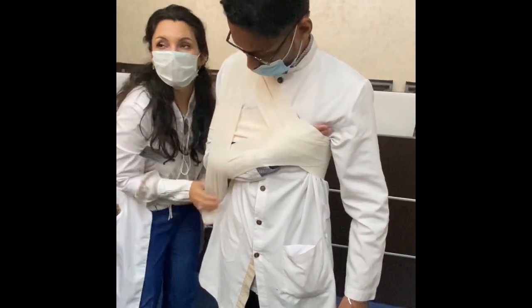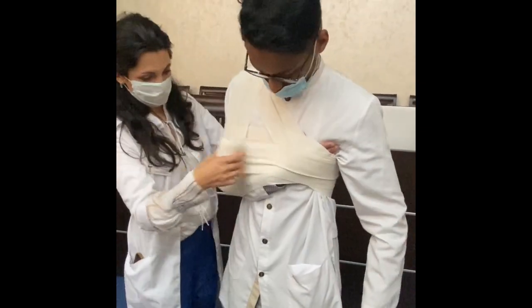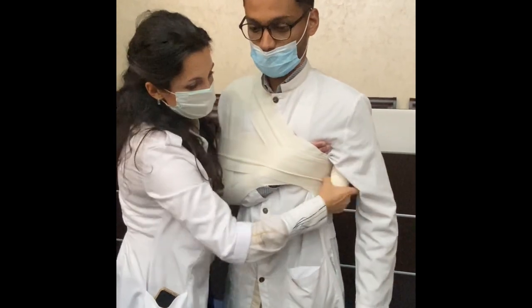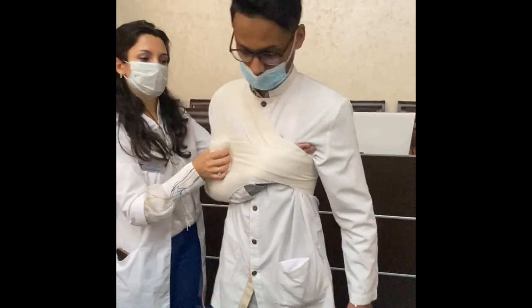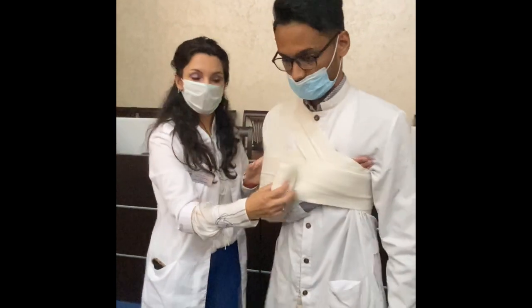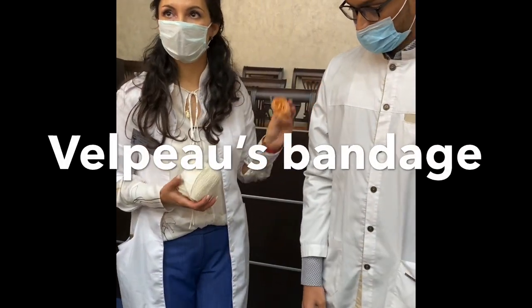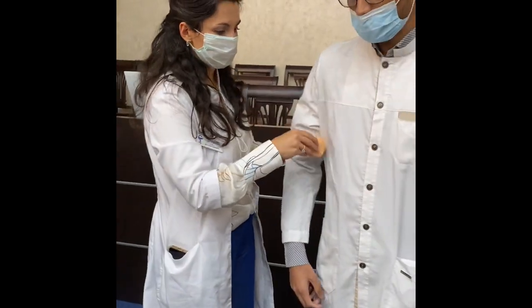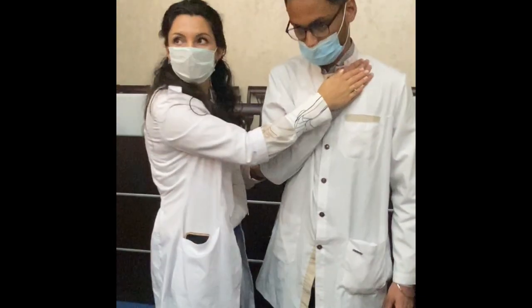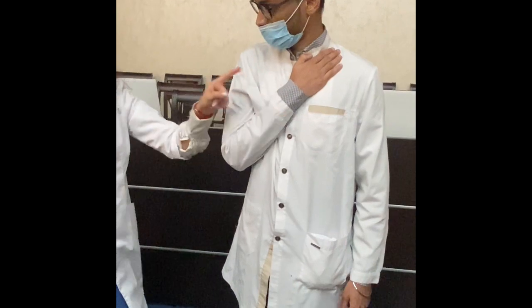Fix the elbow, go on the back, and make fixation. It looks like this. This is the Desault bandage. We ask the patient to hold the hand in this position, and we start not from the damaged side.